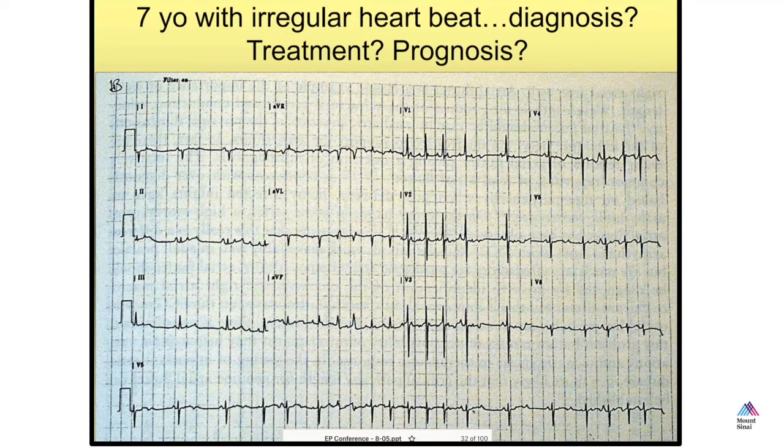I would say initially on the limb leads it was almost 70. Then it keeps on narrowing down. I can see that the P wave looks like a sinus P wave. The axis is positive on lead 1, positive on AVF as well.